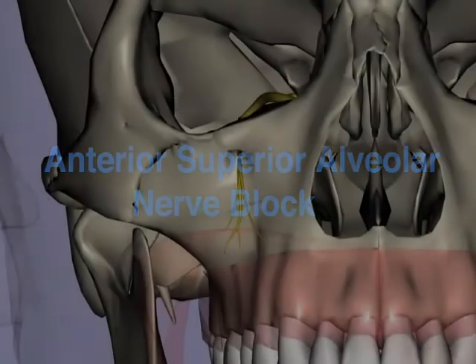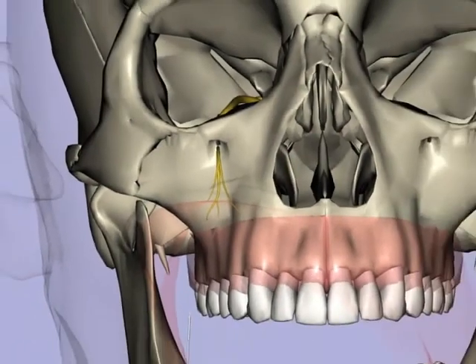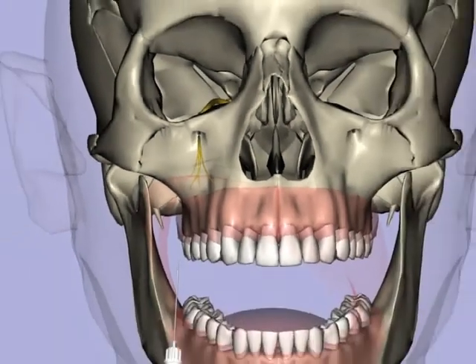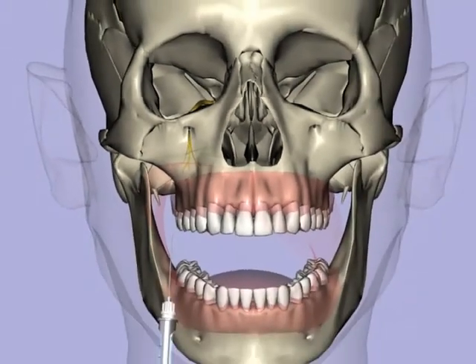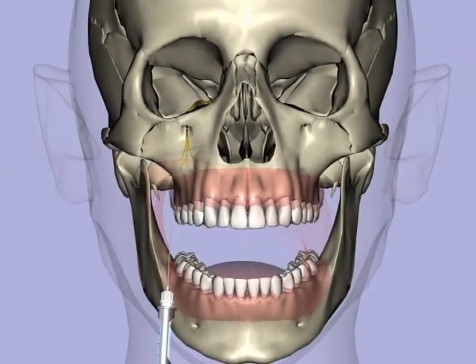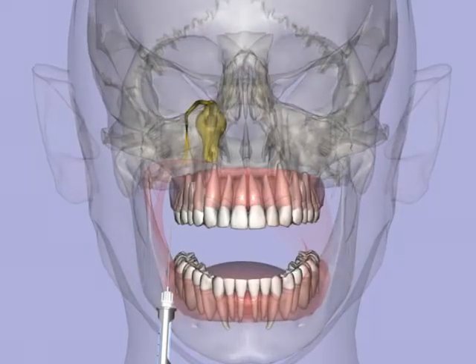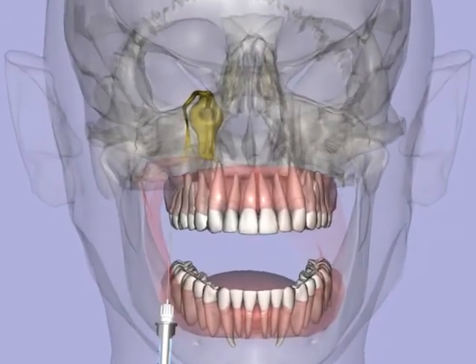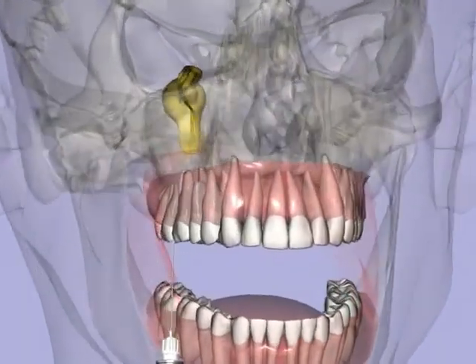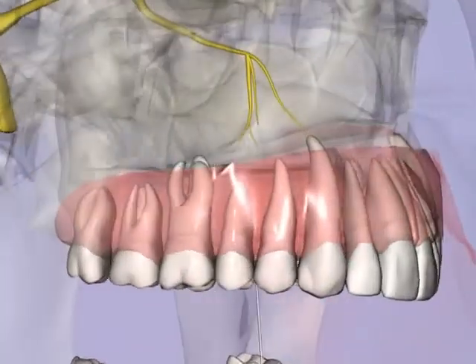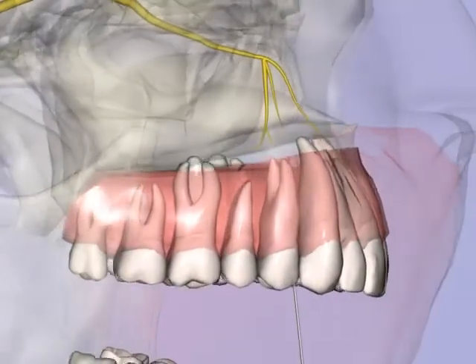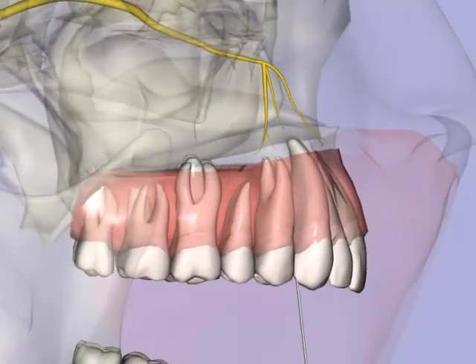The anterior superior alveolar nerve block, or ASA, using a 25-gauge long needle, insert in the buccal fold directly over the first premolar. Advance the needle until it contacts bone at the roof of the infraorbital foramen.